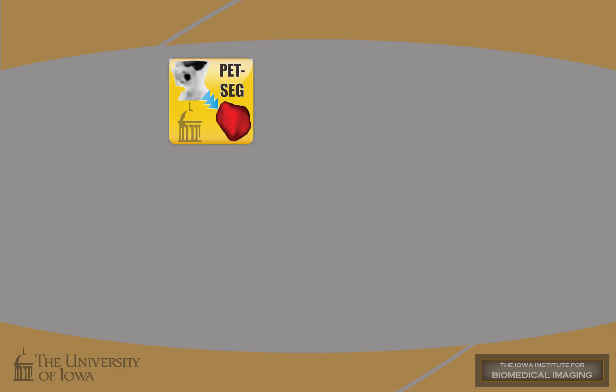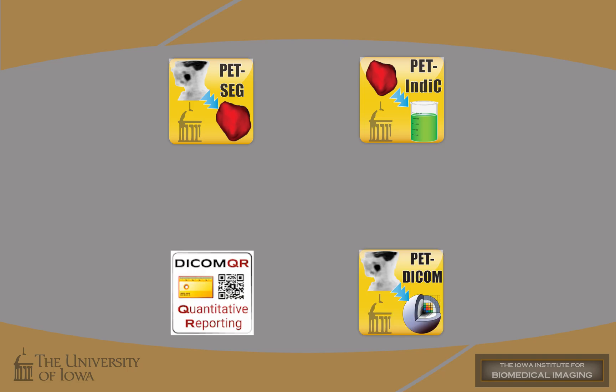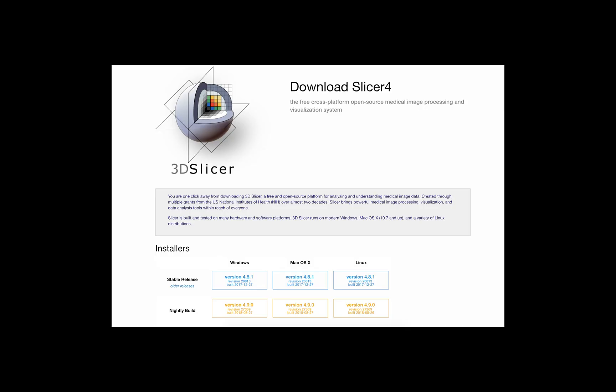We are using this suite of publicly available PET analysis tools developed at the University of Iowa in combination with the DICOM Quantitative Reporting Extension for 3D Slicer, a multi-platform, free and open-source software package for visualization and medical image computing.